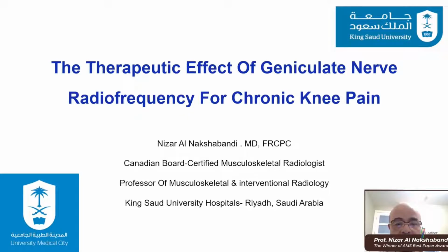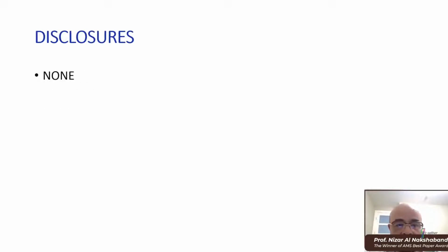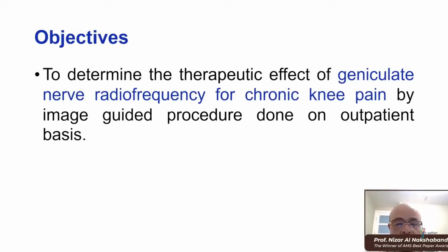Hello, my name is Nizar Al-Naqshbandi, and I'd like to thank the organizing committee for giving me the opportunity to share my work about the therapeutic effect of geniculate nerve radiofrequency for chronic knee pain. In this lecture, we'll be talking about disclosures, objectives, materials and methods, conclusion, and examples of the procedure and its outcomes. I have nothing to disclose.